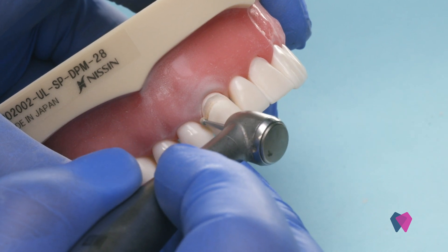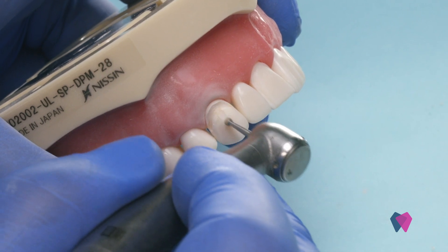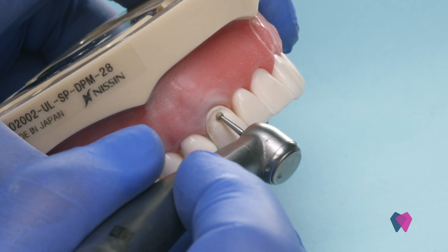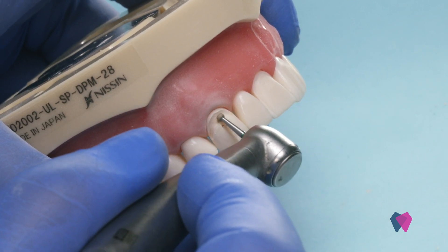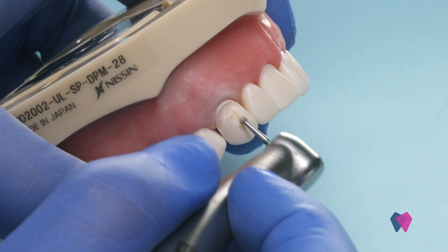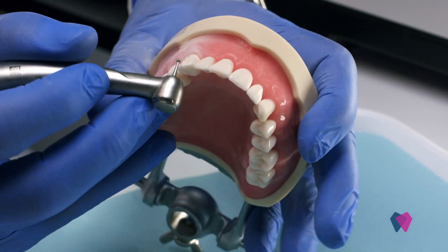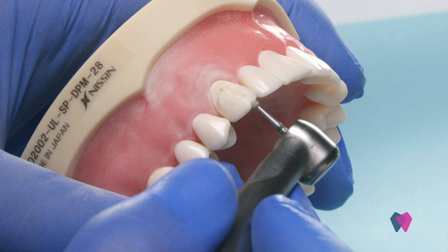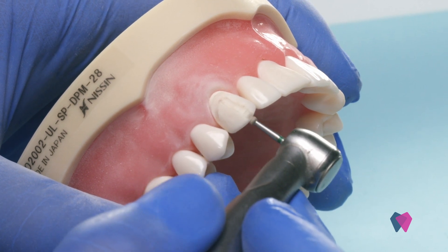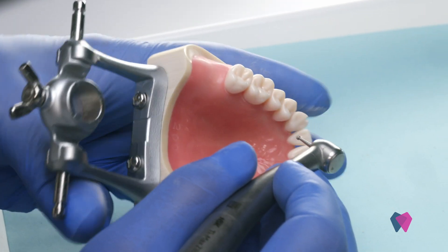We're going to stay supragingival. We're going to come down the incisal. This just ensures that we get enough thickness when we're doing our preparation so that the laboratory can make you a ceramic crown or an all-ceramic crown, whether it's in lithium disilicate or in zirconia.